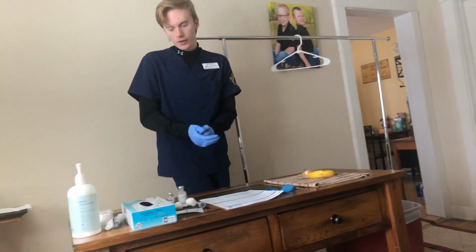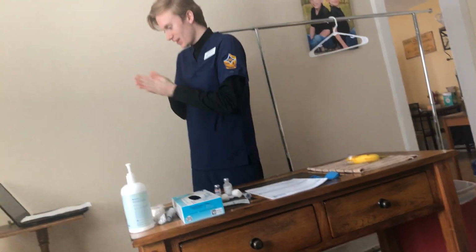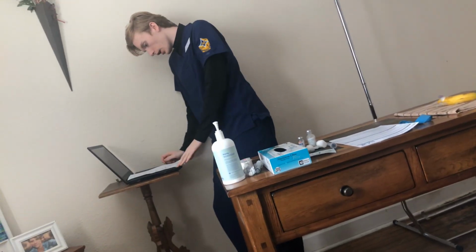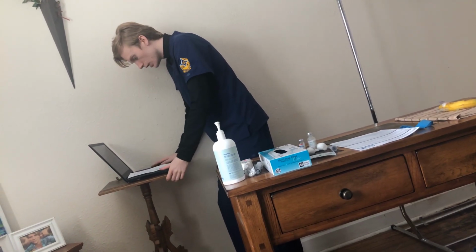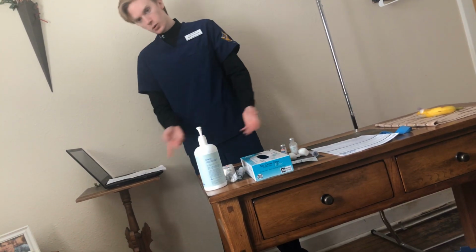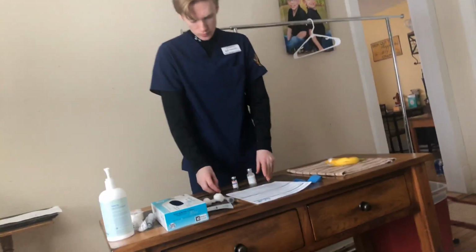Now that we have done that, remove my gloves, head over to the bedside computer, wash my hands again, and document that we DC the original IV infusion of 0.9% NS, 1,000 mils to infuse. DD by D Downing, student nurse at 1200. That's it. We are good to continue with the 2nd step of our procedure. We are going to be giving the IV push medication, so I'm going to draw up my medication.